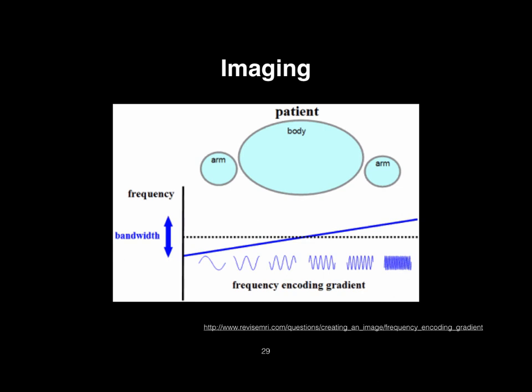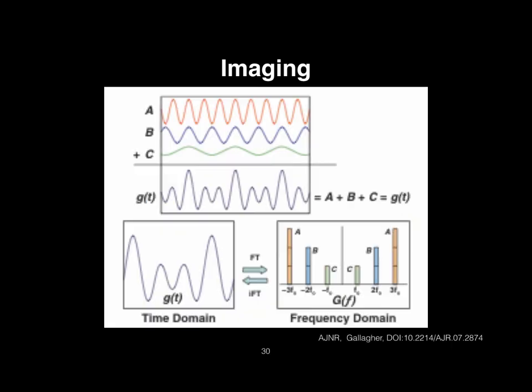And it turns out that when you do this readout, you're reading all of these out together and aggregating it. And you end up with a signal that looks something like this. It turns out there's a little bit of math called Fourier theory.